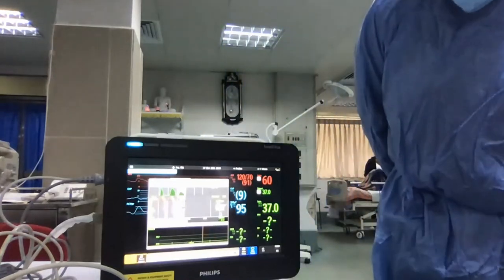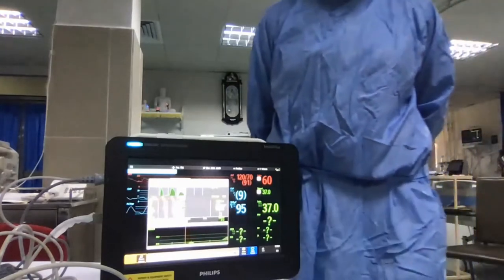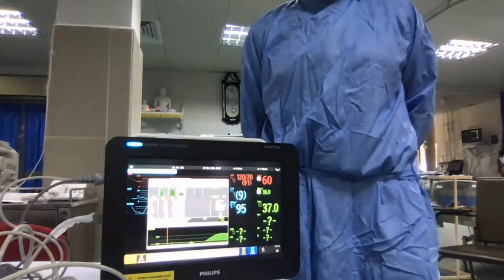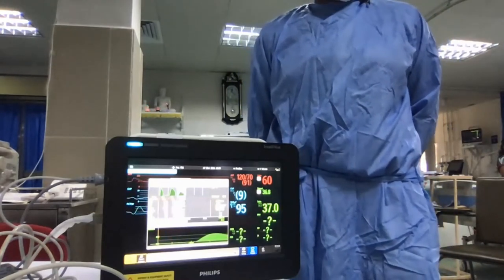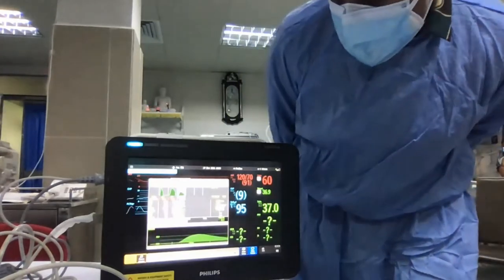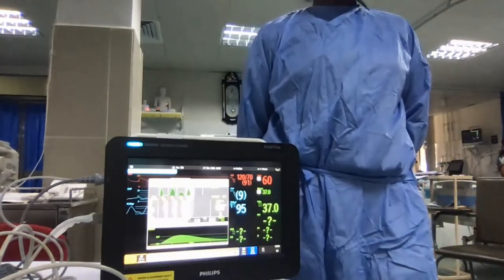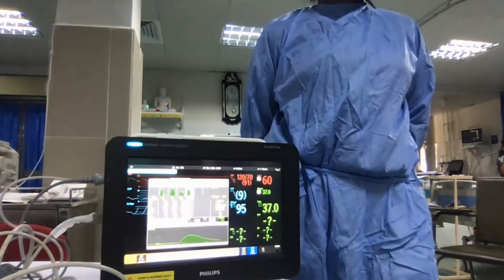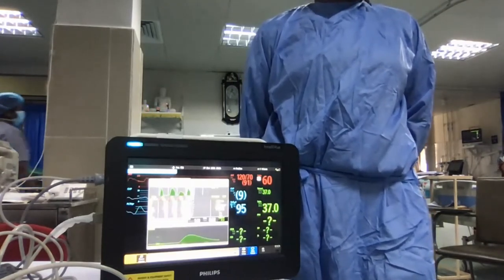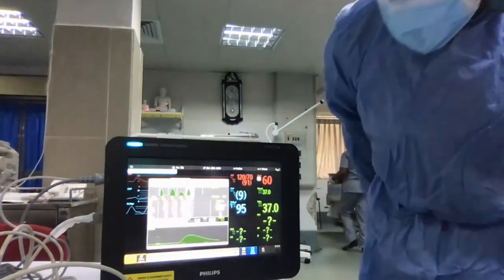For index values, you have to enter the patient's age, weight, height, all the demographic data. Then only you can get the indexes. If you don't enter them, you will get the cardiac output and SVR, not the SVRI index. The index is the most accurate for that particular patient. Otherwise, the monitor will use data already available in the machine, an overall number from population data already fed to the monitor, which is not appropriate to the patient.